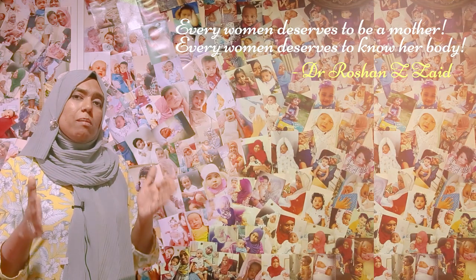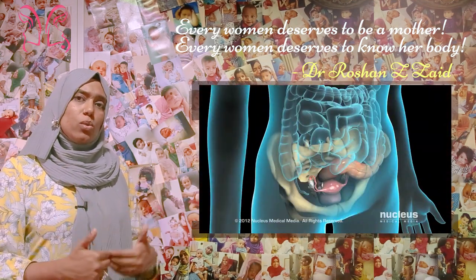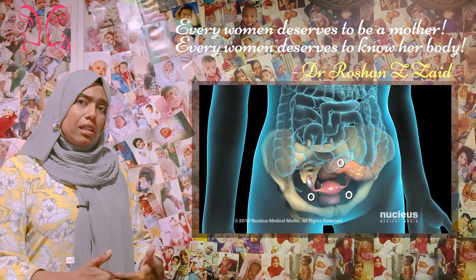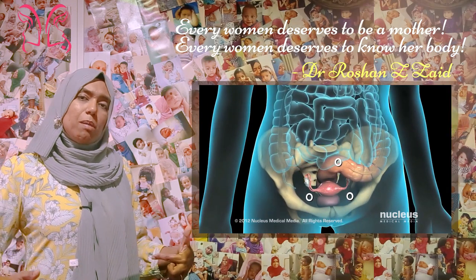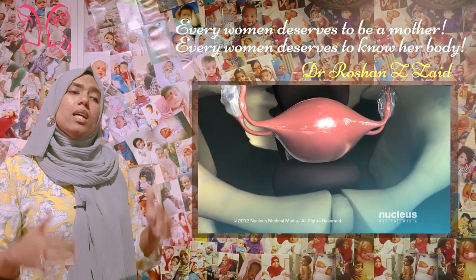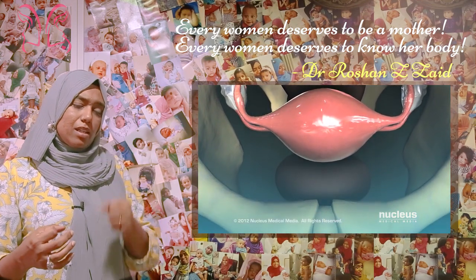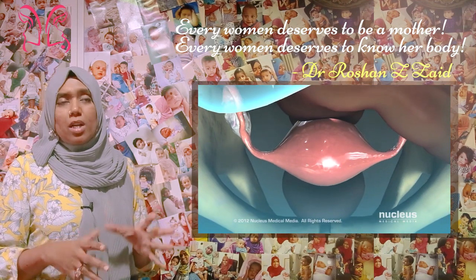Laparoscopy is a simple keyhole surgery where we introduce a camera into the pelvic or abdominal cavity. A little camera is inserted through the belly button and maybe one or two holes on either side of the belly button. The tummy is filled with gas and then cameras are inserted to view and visualize what is inside the pelvic cavity.